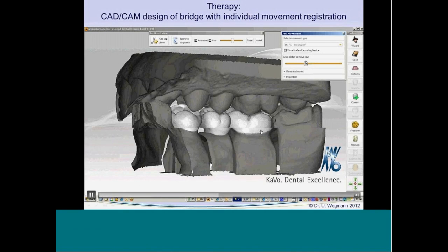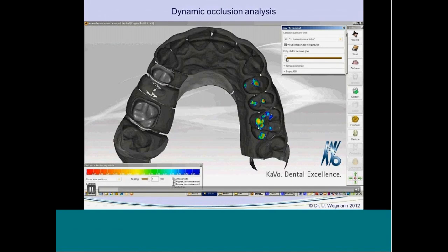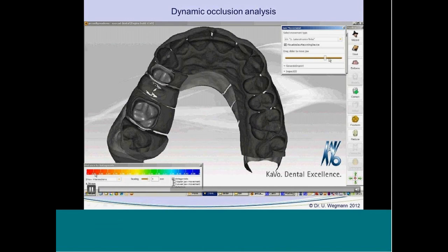When you do some prosthetics on this side, you can check, is there any disturbance on the other side, on the natural teeth, because here you can see the distances between the upper and the lower jaw as color-coded spots here, and then you can decide, okay, here's some disturbance, there I have to adjust the natural teeth. That's also very helpful.